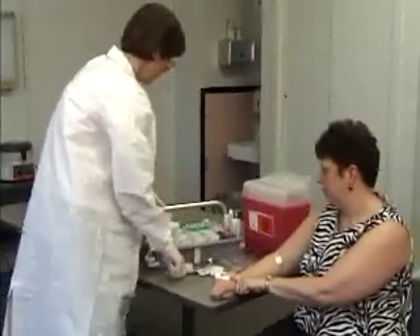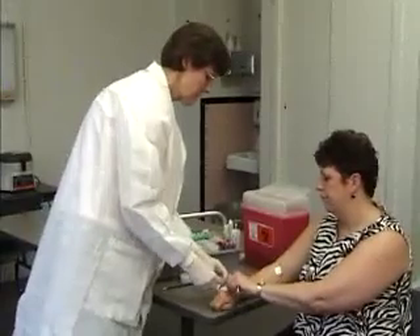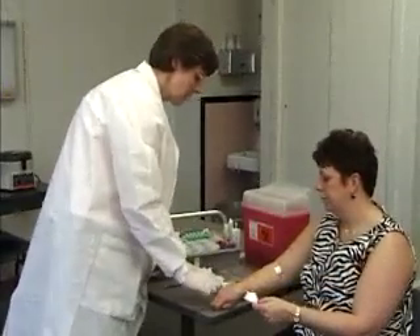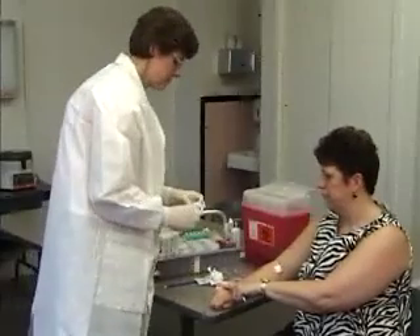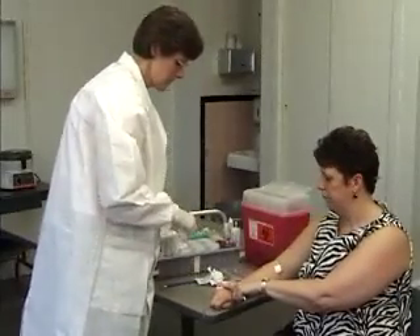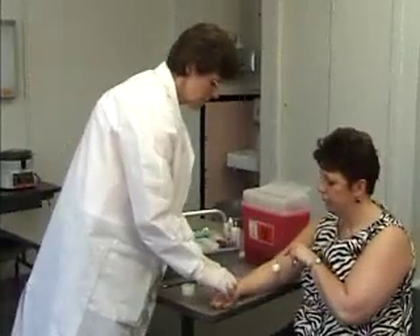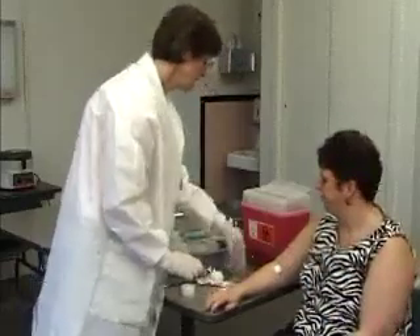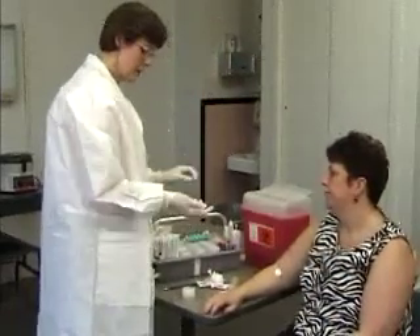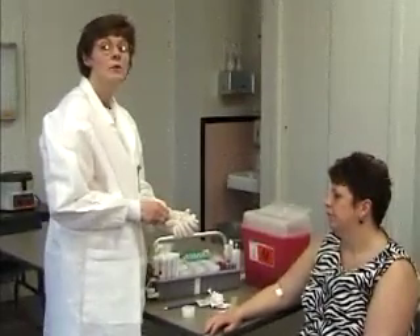I'm going to put it in a Ziploc bag to go to the laboratory, and I'm going to bandage my patient. You can take that off in about 30 minutes. You would send your blood to the laboratory, and you want to take your gloves off and wash your hands.